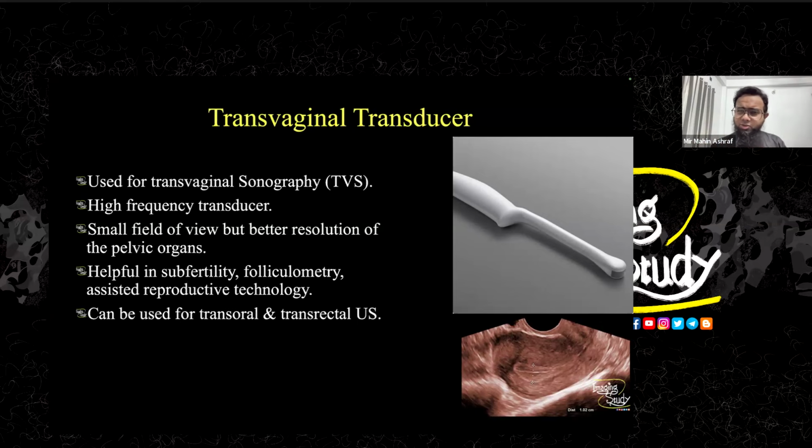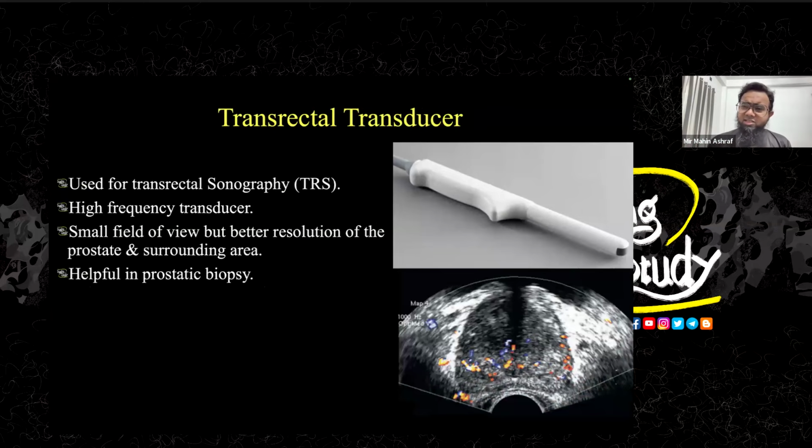I use this transducer. It's very comfortable to see those structures with this one. So it's widely used for obstetric and gynecological purposes, actually, but I want to tell you some different aspects of this transducer.